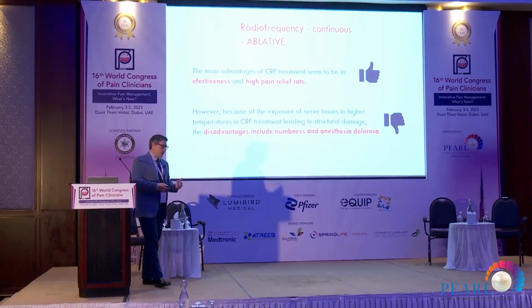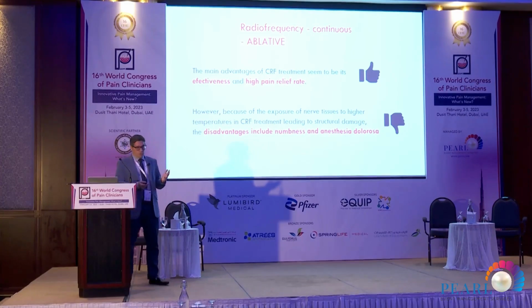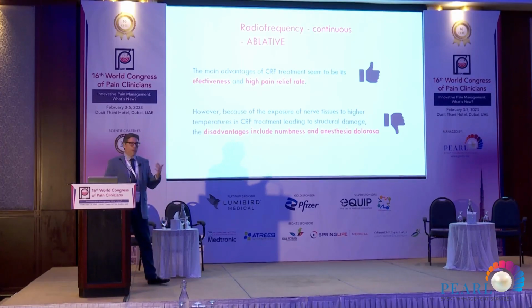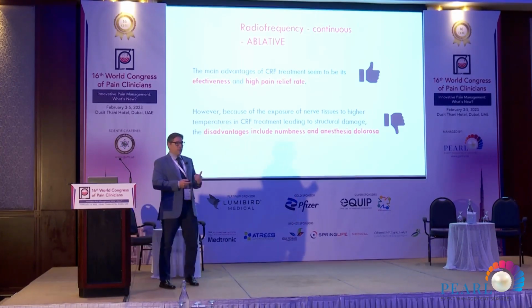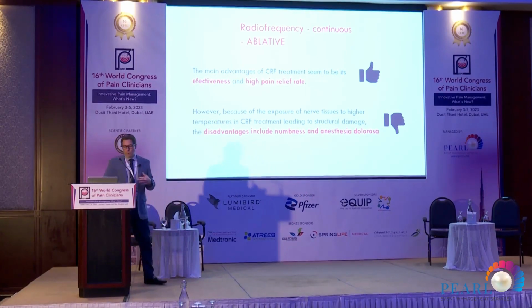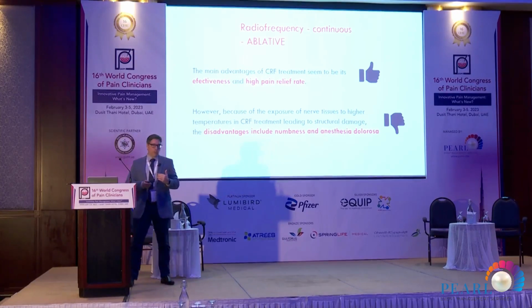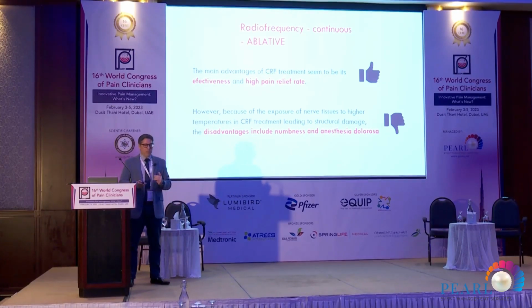And of course, as with all things in life, we have some advantages and some disadvantages for the procedure. The advantage seems to be the higher effectiveness rate, the high pain relief rate, but we also have some disadvantages associated with that, because we have more complications like neuroma formation, numbness, anesthesia dolorosa, deafferentation pain, and other conditions. We know that those kinds of complications can occur with PRF as well, but that's why we have to pay attention to some adjustments and to the parameters we are going to use.